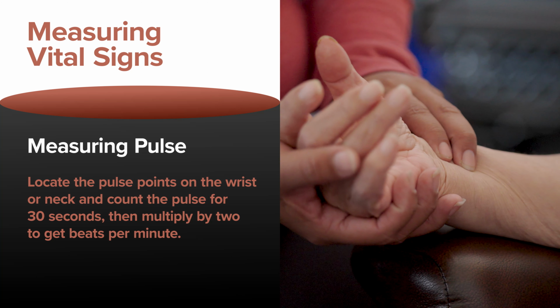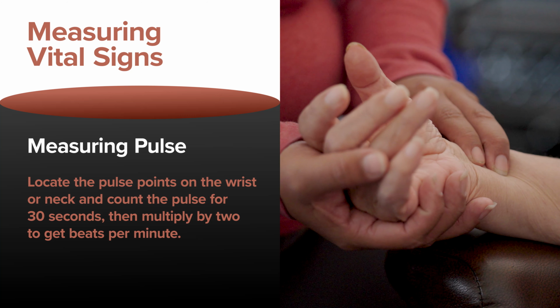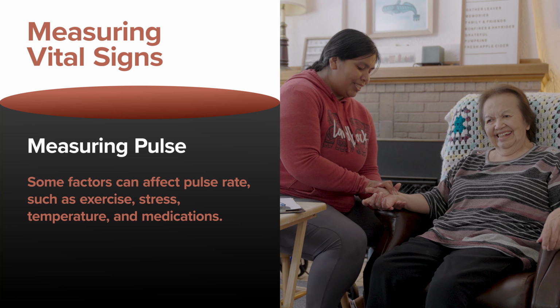Measuring pulse. Locate the pulse points on the wrist or neck and count the pulse for 30 seconds. Then multiply by 2 to get beats per minute. Some factors can affect pulse rate, such as exercise, stress, temperature, and medications.